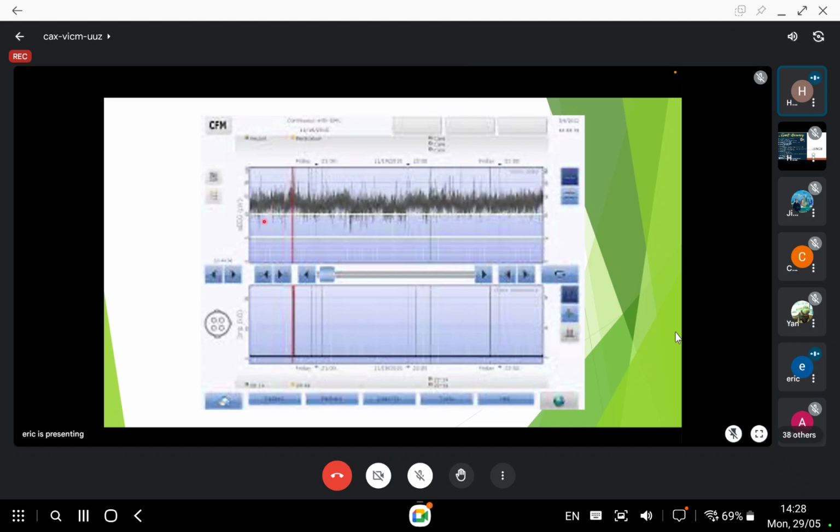It is above 5. Okay, and is the upper limit above 10? It's above 10. So both are above 5 and above 10, right? So what should it be? It's a continuous. Correct. So it's a continuous background activity.